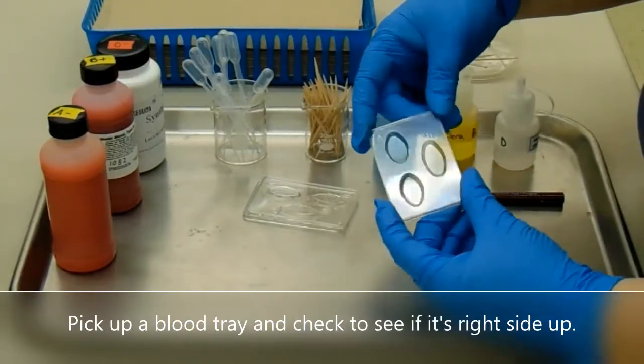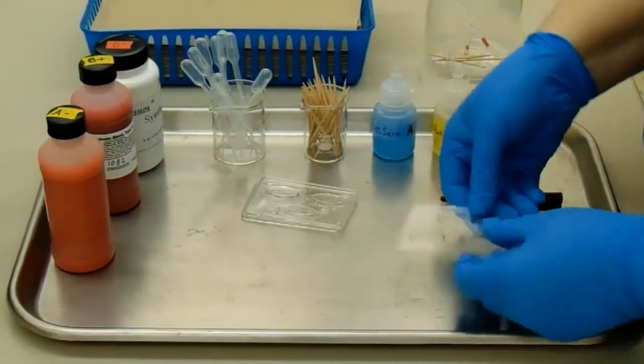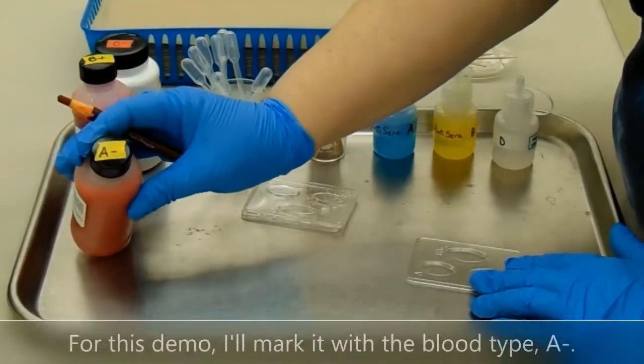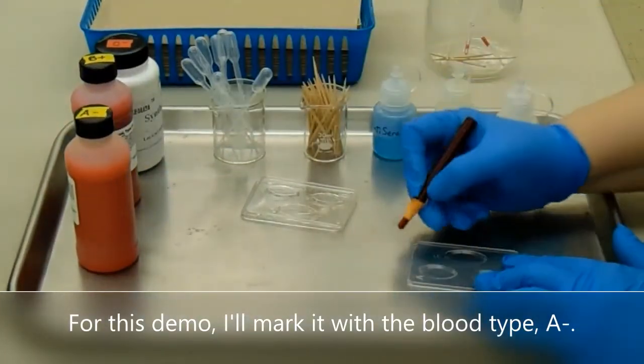Pick up a blood tray and check to see that it's right side up. Use the wax pencil to mark the tray. For this demo, I'll mark it with the blood type A negative.